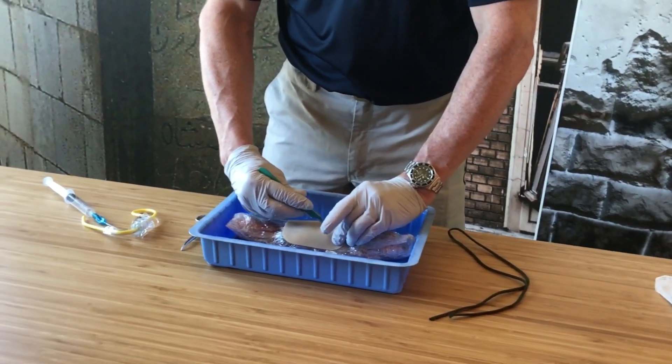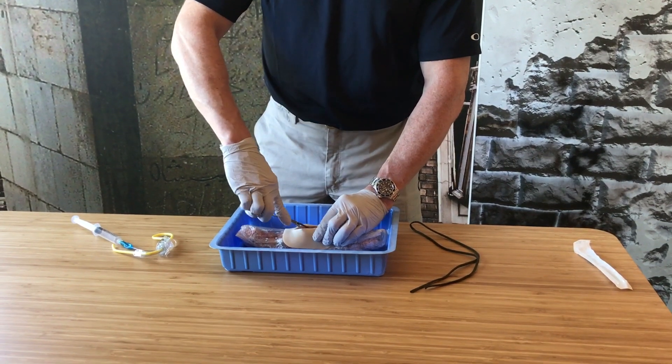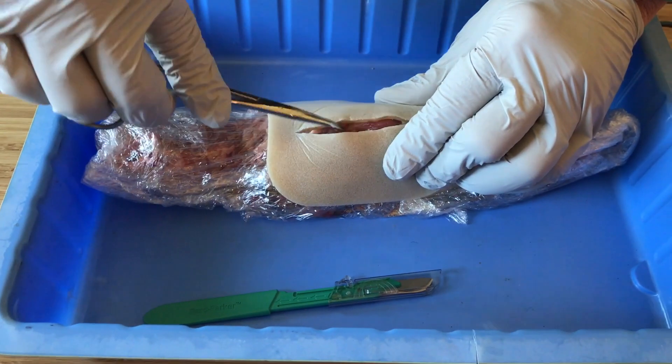I make an incision through skin and overlying soft tissue. I take my mosquito forceps, go in, and start blunt dissecting out tissue.